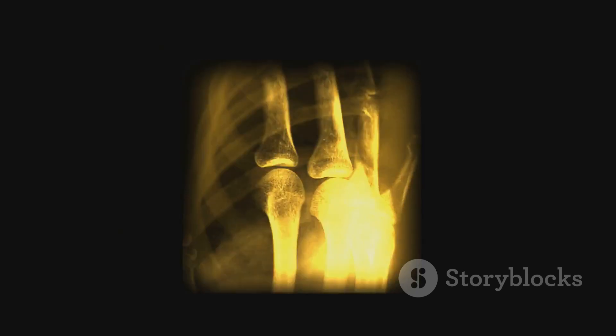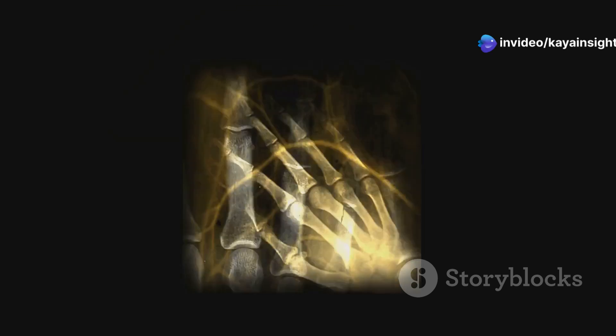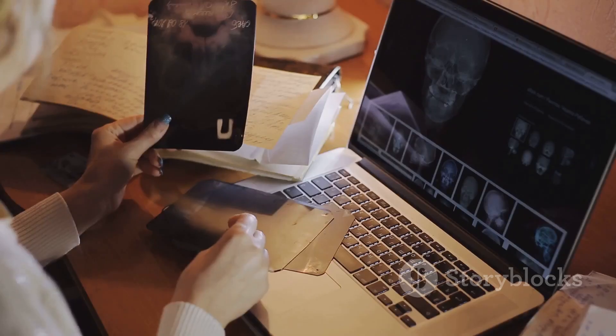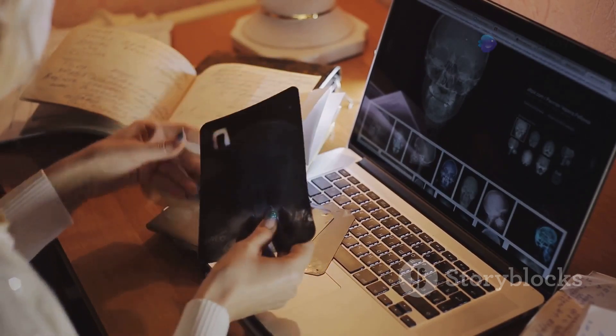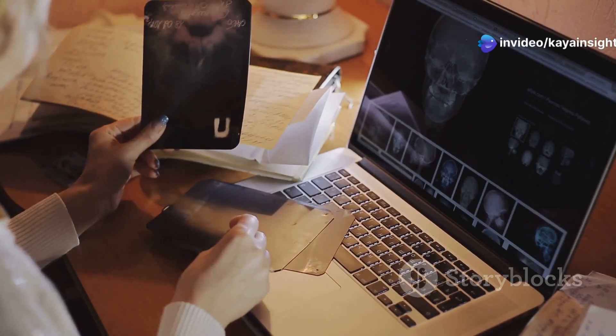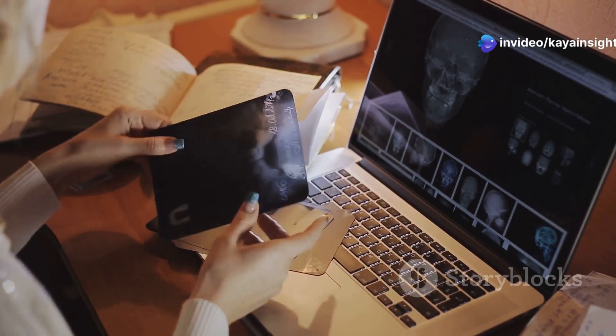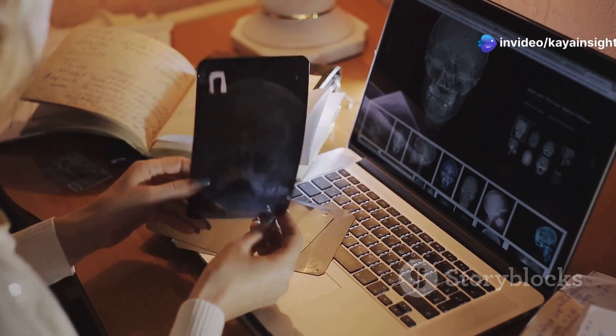On an X-ray image, these areas will appear darker because more X-rays have passed through to the detector. This contrast helps in identifying different tissues and structures within the body, such as air-filled lungs or soft tissues, which are typically radiolucent. Understanding the concept of radiolucency is crucial for interpreting X-ray images accurately, aiding in the diagnosis and treatment of various medical conditions.